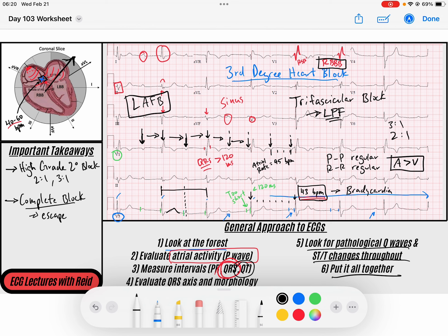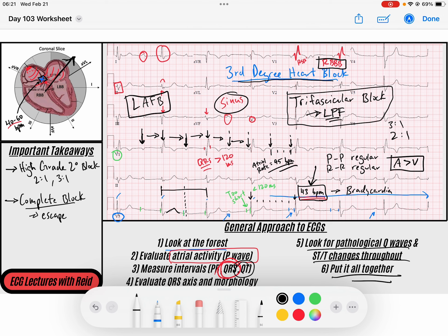Putting this all together: I have a sinus rhythm with the sinus node beating at 95 beats per minute, however I have a third degree heart block with an escape rhythm at 43 beats per minute in the pattern of a right bundle branch block and left anterior fascicular block - I would call this a trifascicular block. Remember, trifascicular block is not just a bifascicular block plus any AV block - it has to be a progressing block, meaning not just a first or second degree block. There needs to be something showing that last fascicle is also blocked.